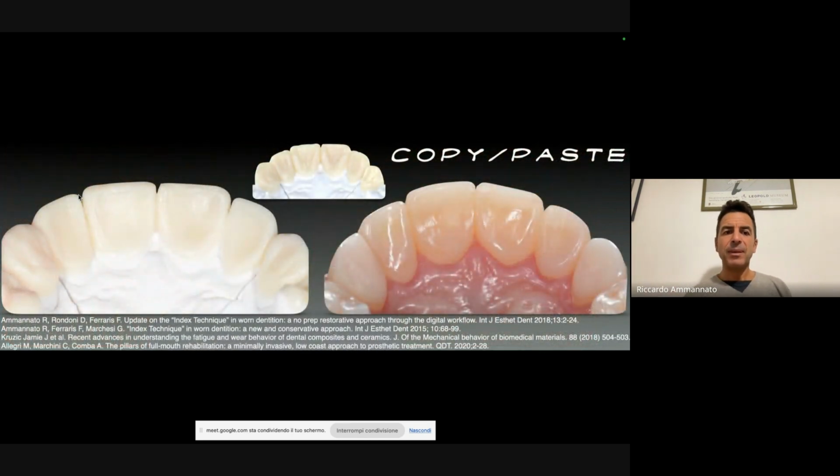Here we have the initial project that we delivered for the test drive, but for the phonetic, we had too much volume here. So I asked the technicians to decrease the volume and to go to this kind of design, and this is what we deliver to the patient.